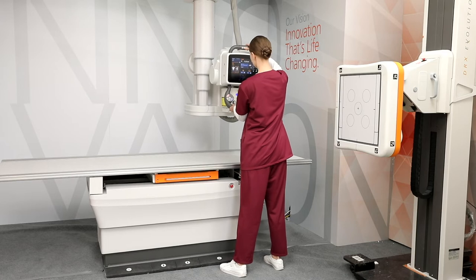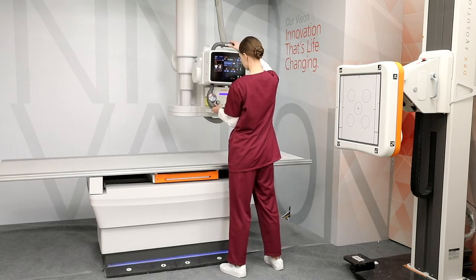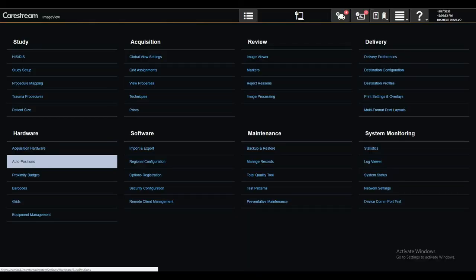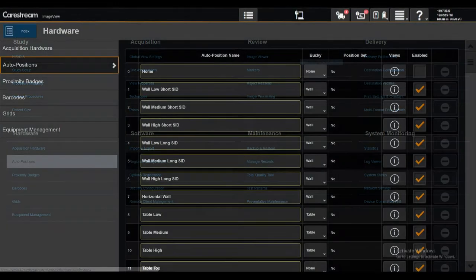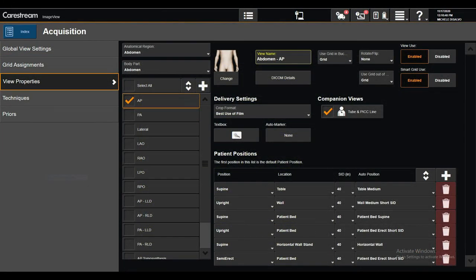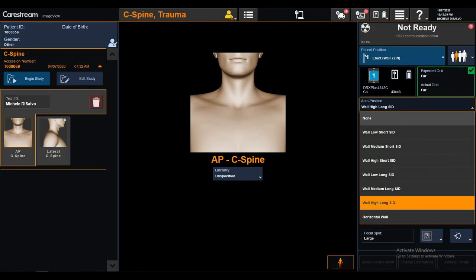Optional motor assist enables easy manual overhead tube positioning, reducing operator fatigue. There are also exam-specific pre-programmed positions for both the tube and bucky, as well as generator and collimator settings for maximum efficiency.